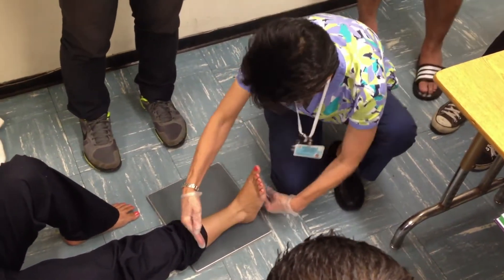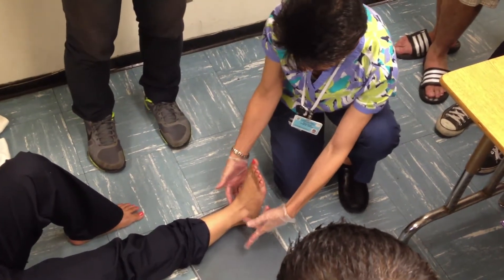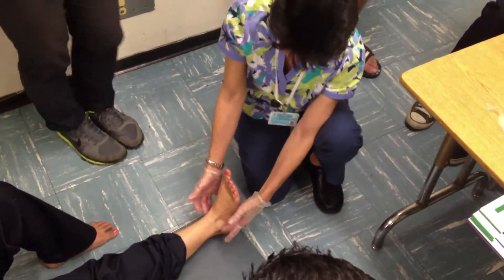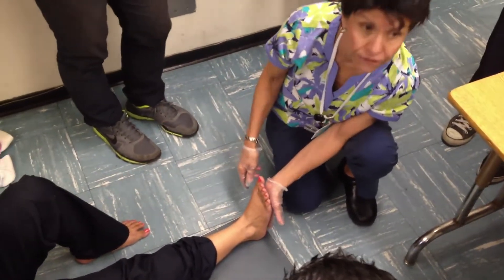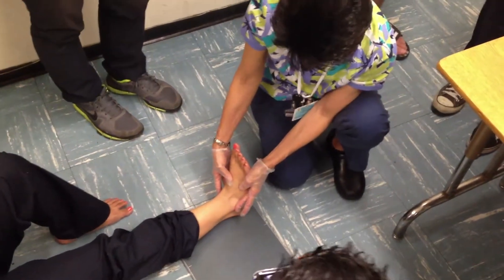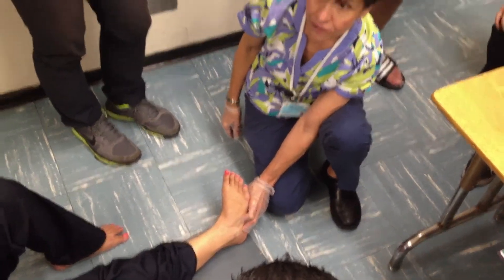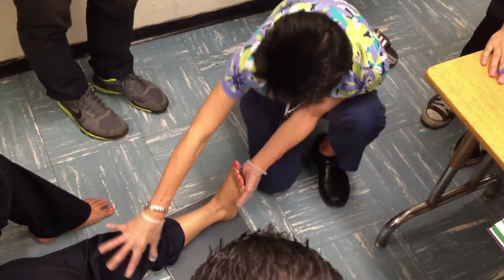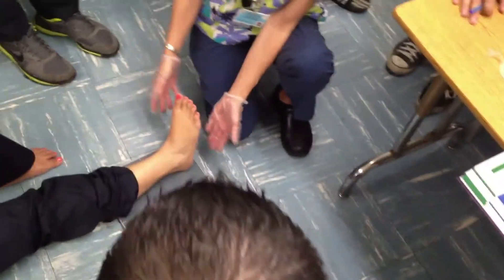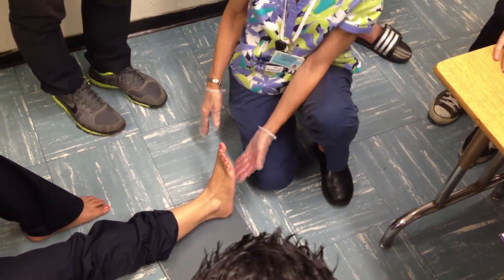CR is going to be here, and then I'm going to collimate. I'm going to do a mortise — roll in slightly. On the mortise, the malleolar line needs to be parallel. It's about 15 degree obliquity. Same CR here, same dorsiflexion. If they don't want the mortise, then we're going to do a 45. Make sure they don't just do the foot — this is not an oblique ankle. It's the foot and the leg. Students end up just doing the foot and it's like, that's not anything.